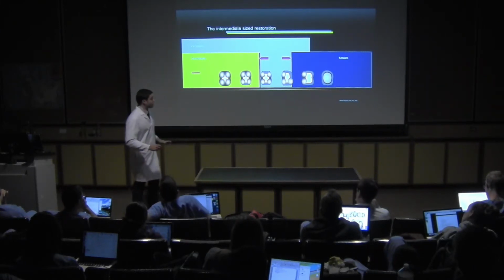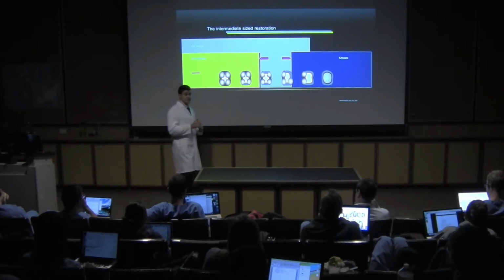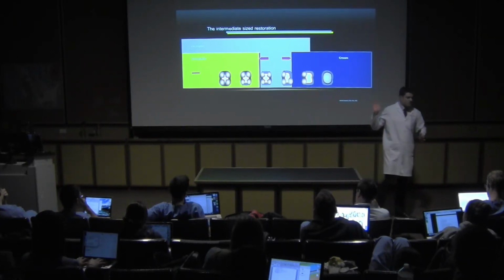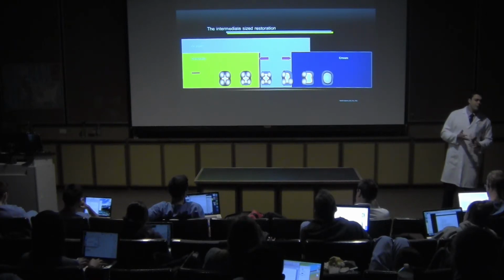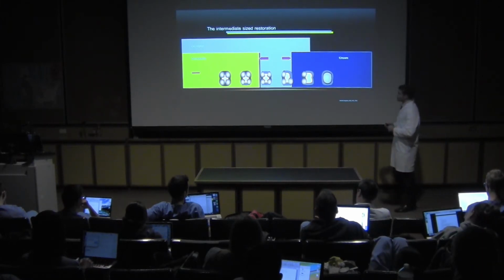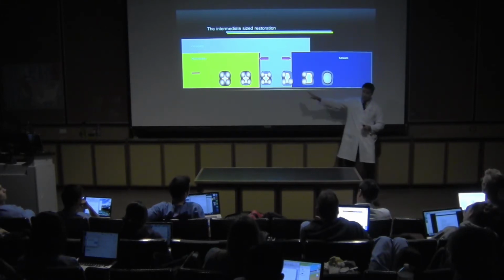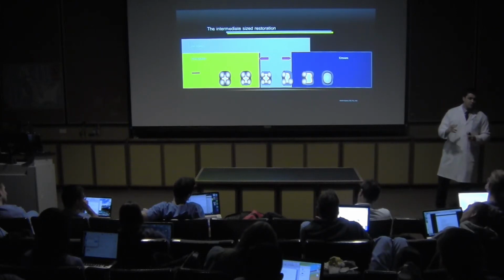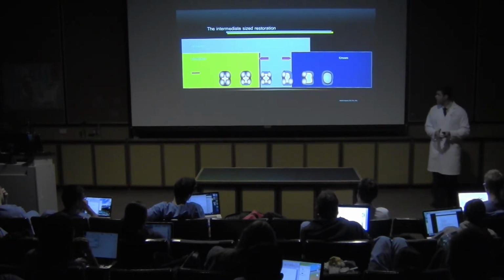Not a problem. In this type of prep, you saw last lecture that we work with amalgam, we need the amalgam pin, some retention grooves. Remember that? So now, what we are going to do on this type of preps is work with these Inlay Onlay preps, thinking differently about the material that we are going to use to restore.